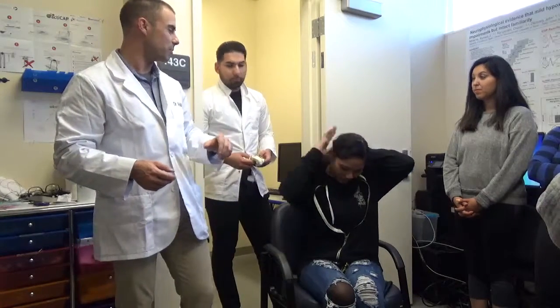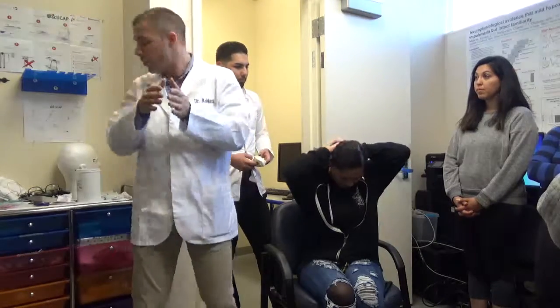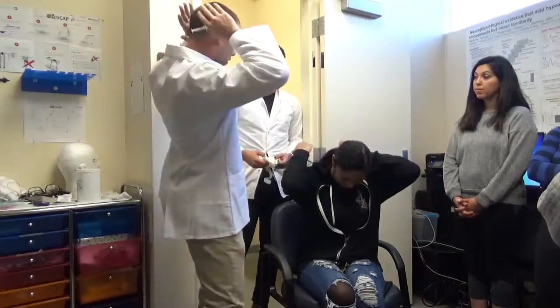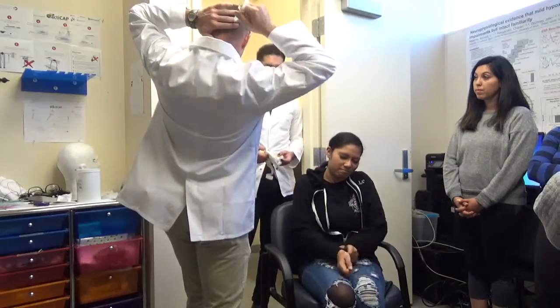Alright. And it doesn't have to be super tight either. Actually, a little loose is pretty good, because we're going to end up using our syringe tip to go through the back of the head where all that hair is matted up. It creates a layer, and we're going to have to go through there and create a channel.